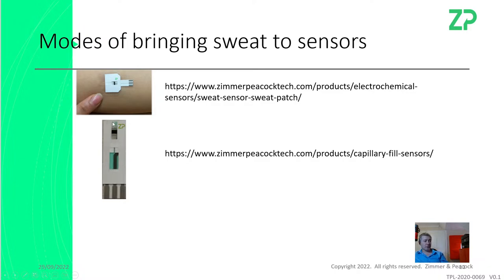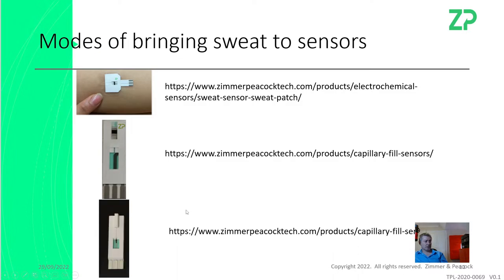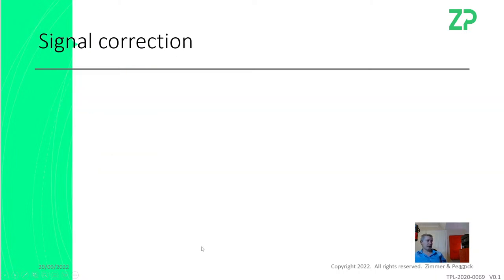And that's perfectly fine for an ISE, an ion selective electrode. We do have these filters. I don't really think these filters are needed; the reason they exist is for filtering things like blood. Blood is quite a dirty matrix actually, whereas sweat is relatively clean compared to blood. So these filters are really for filtering out proteins and red blood cells, giving you a serum sample. When you've filtered blood, you're left with the serum, which is more transparent, slightly cleaner than blood itself. So for sweat analysis, the sweat patch is a good idea. The capillary is fine, but I wouldn't recommend the filters. It's not what it's intended for.